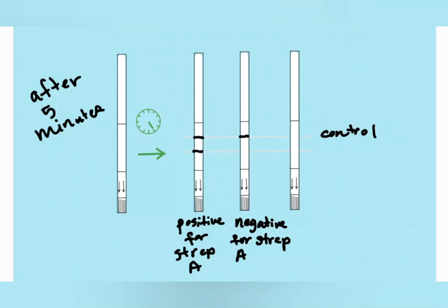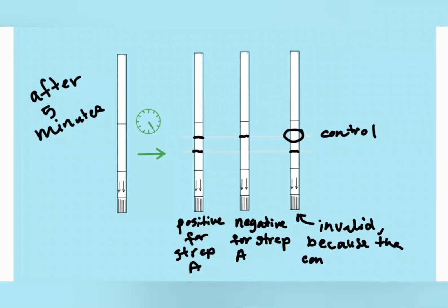The kit might be expired, or there might be something wrong or defective with the reagents — maybe you missed a step. If that happens, try again with that kit after reading the instructions. And if you are still getting invalid results, try a different test kit. Running a positive or a negative control test using those solutions that come in the kit is a good way to see if what's going wrong is something wrong with the kit or if it's something wrong with your technique.